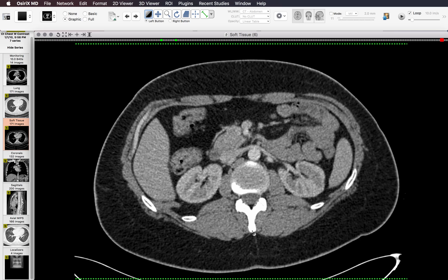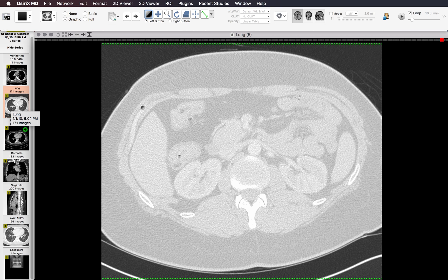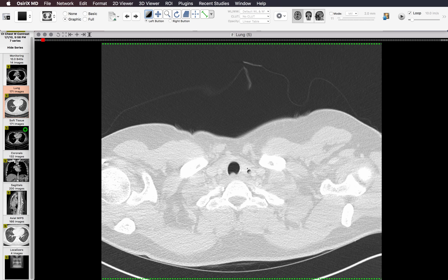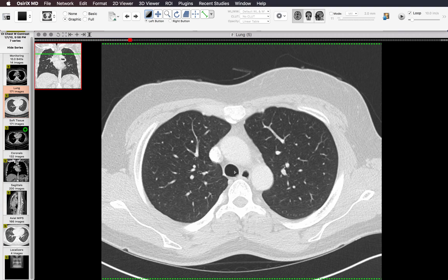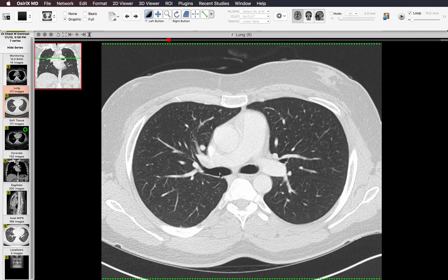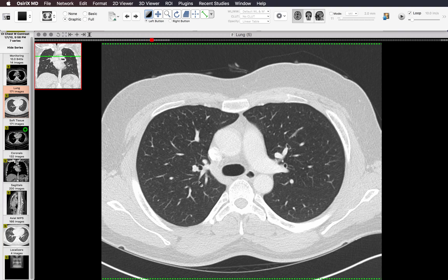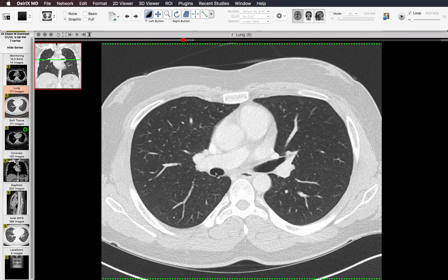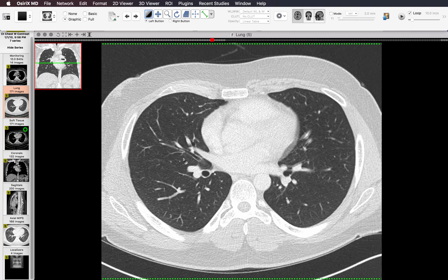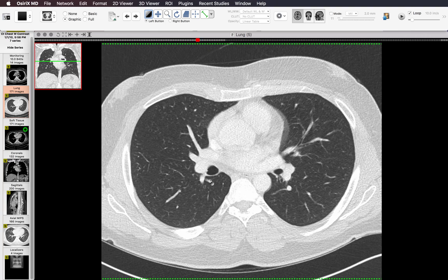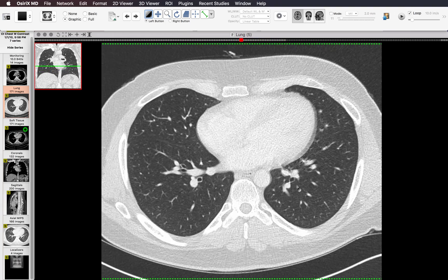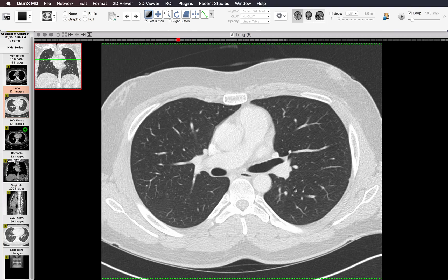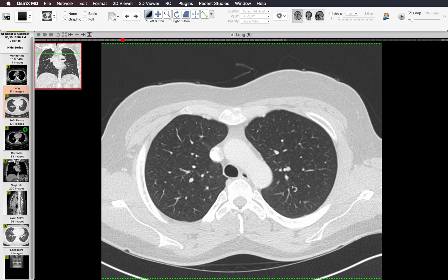Now it's time to look at the lungs. I pull up the lung windows and start with the airways — making sure the trachea and central airways are clear, following each airway out to its lobar and segmental bronchi. I have a video on segmental anatomy on CT, and it's really important to learn that so you can localize things in the lungs based on the segment, not just the lobe.